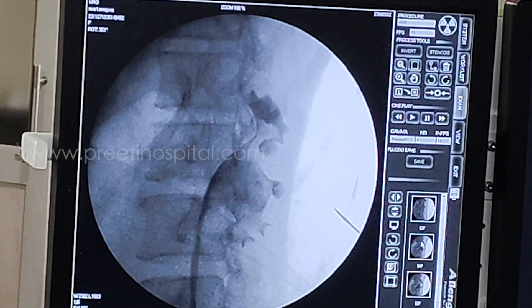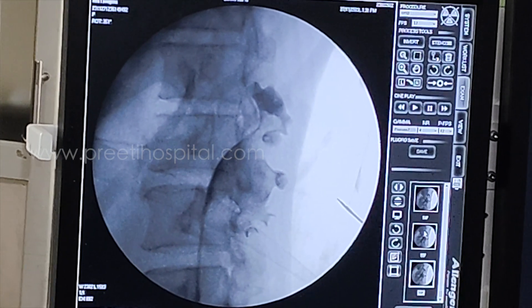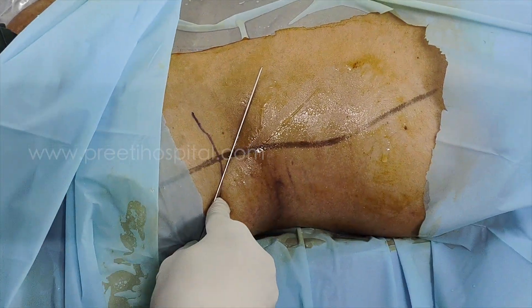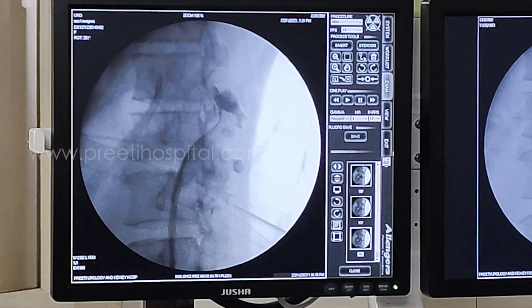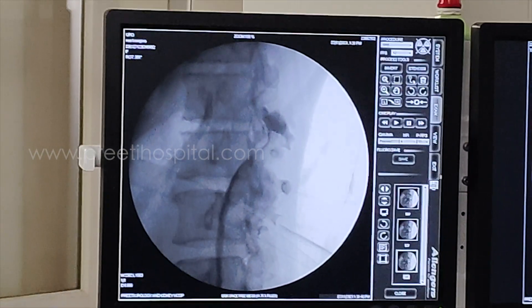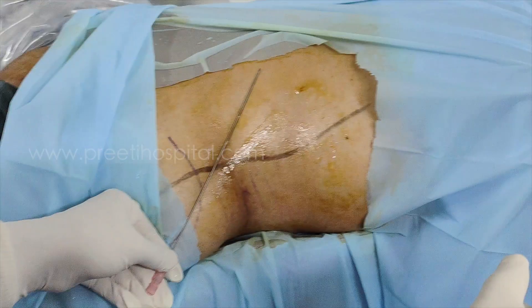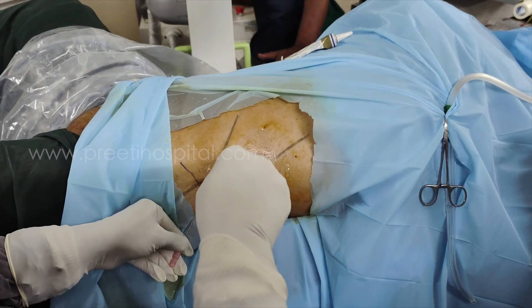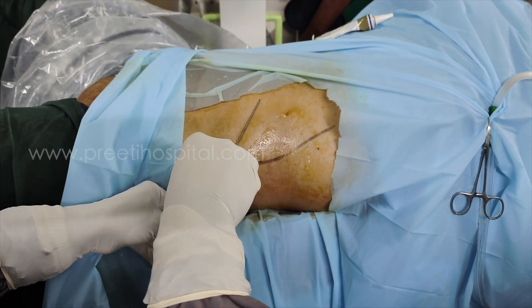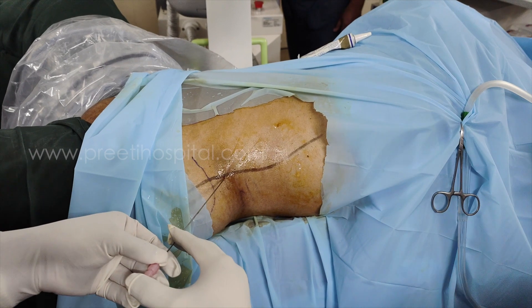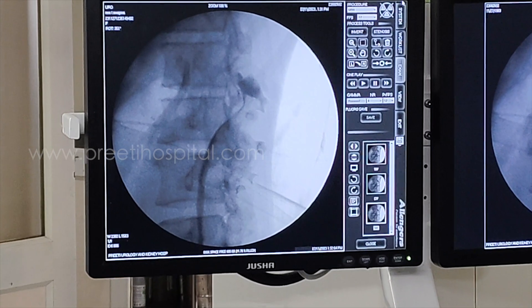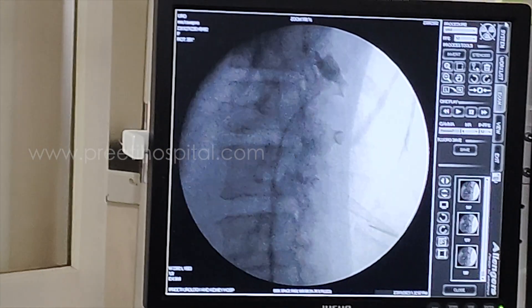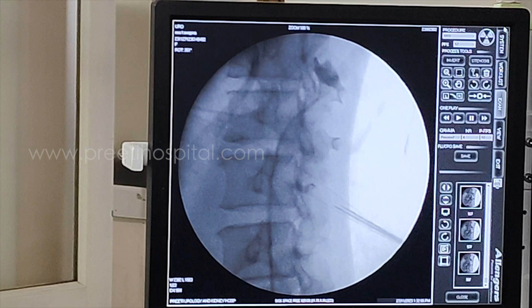This is what the picture shown on ultrasound — this is the variation we are seeing. He has kept a deep inspiration. In that case, this calyx I wanted to puncture — exactly it has come to the same position. Only the direction of the needle is changing. I will try to go anterior, because the lower pole has no colon and the lower pole is more anterior. My aim in supine PCNL is anterior. But you should not go in a horizontal position, as at the same time you cannot hit both the colon and the target.